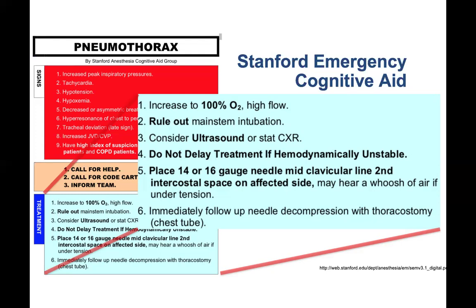Remember, if it's a mainstem intubation, you won't see lung sliding on the lung that is not being ventilated. But if you put it in M mode, or motion mode, you can evaluate the tracing and see if it's a true barcode sign or if it looks, as I comment, kind of barcodey-ish, and it looks like there is some actual artifact from the heart or the lung pulse.